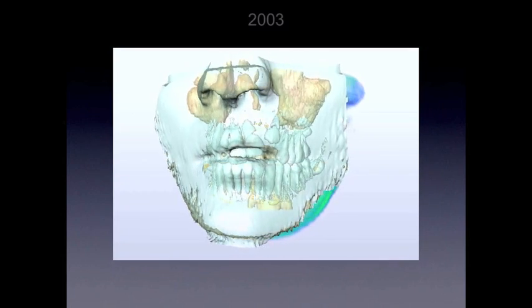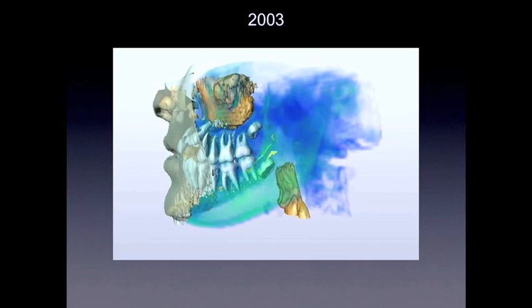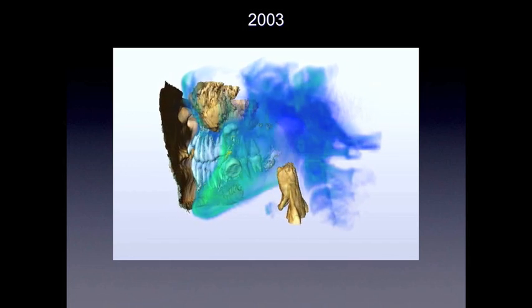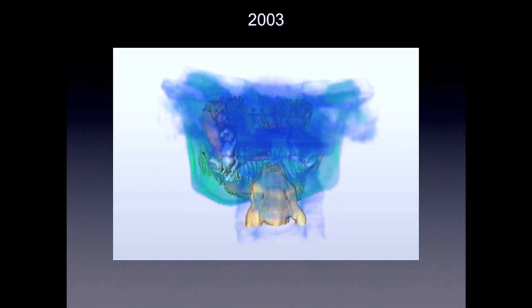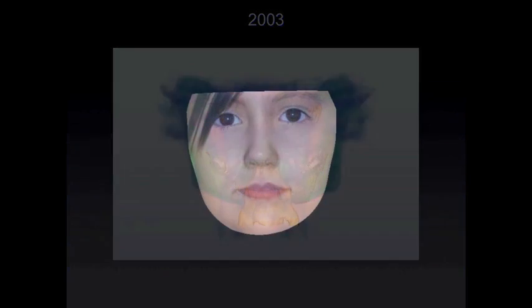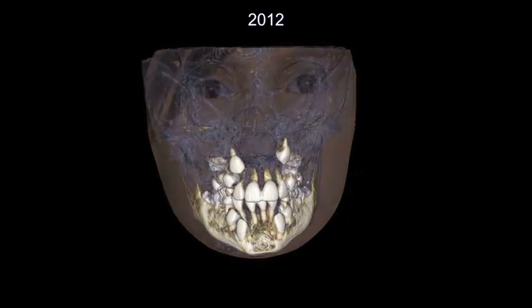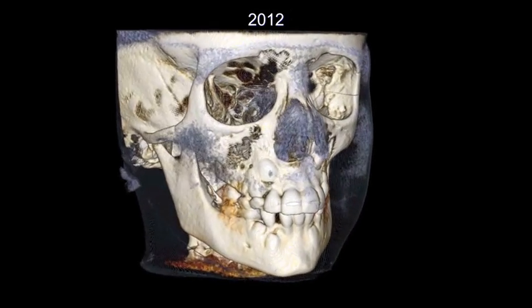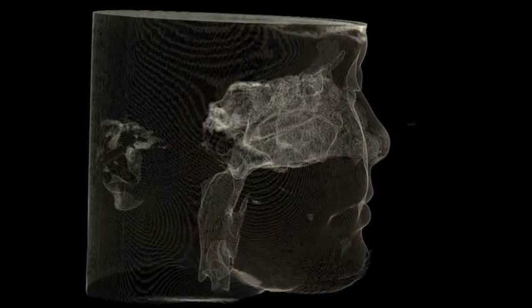We started to build these three-dimensional patients even as far back as 2003. Most of you familiar with cone beam CT imaging at this stage know that our modeling is now very advanced, and the amount of patient exposure to acquire this digital model is extremely low. That's what I want to talk about today.